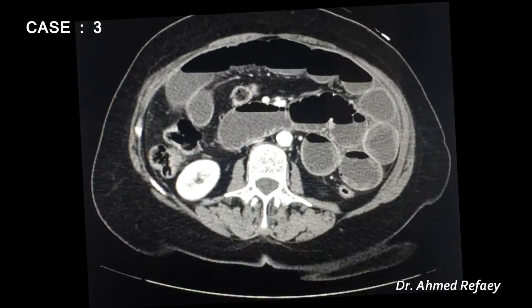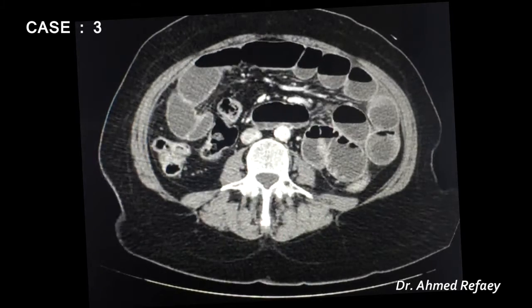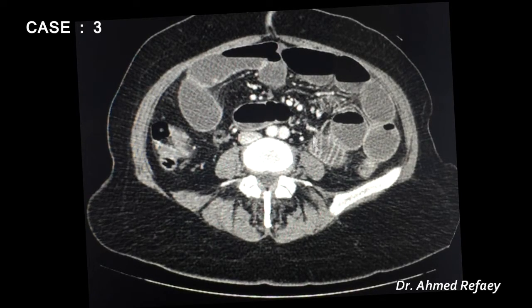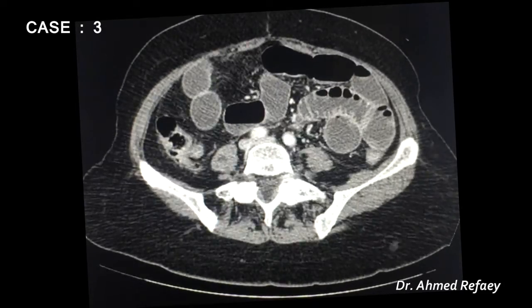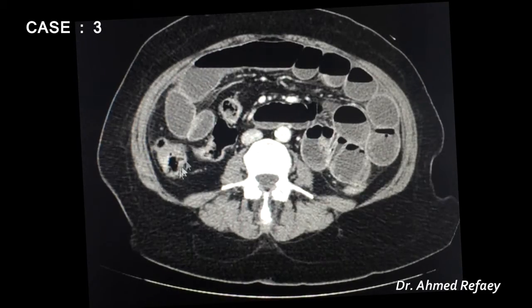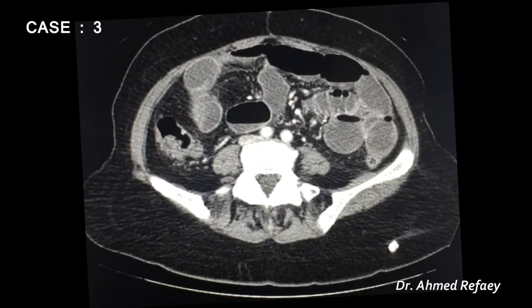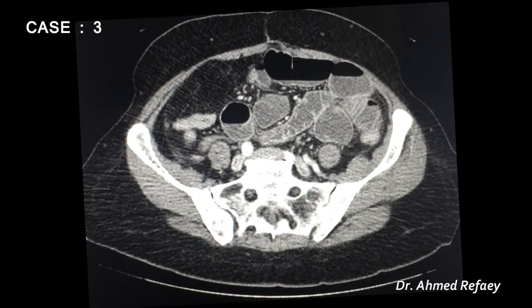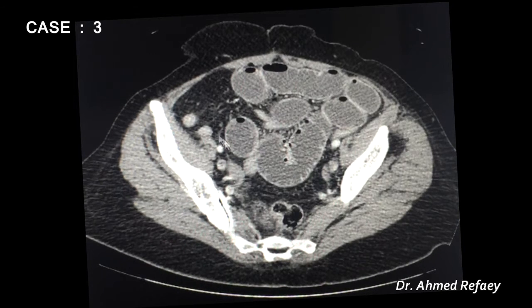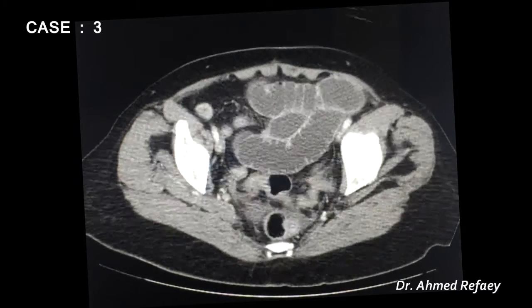Marked dilatation of the proximal small bowel loops is seen with characteristic valvulae conniventes. Tracing from distal to proximal — starting with the ascending colon, cecum, and terminal ileum — the terminal ileum and distal ileal loops are collapsed, with proximal small bowel dilatation. We trace these collapsed distal ileal loops in the right lower abdomen toward the zone of transition.